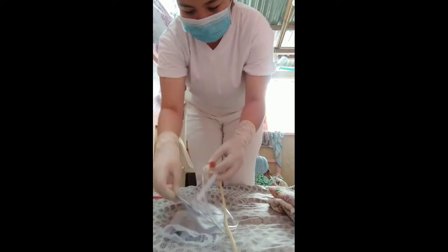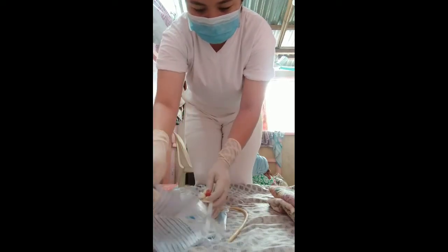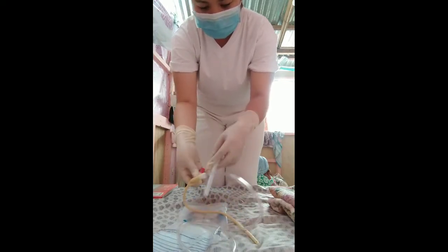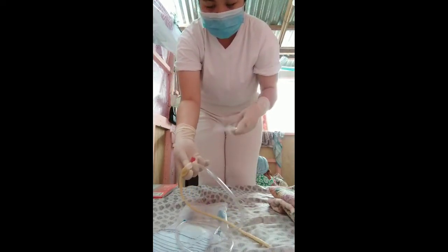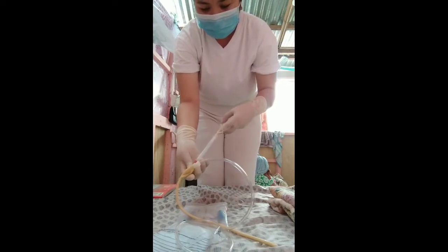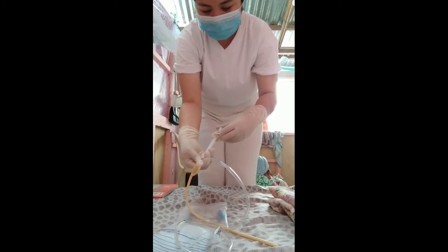So this is the catheter and the urobag. Let's assume that we insert the 10 cc of water into the port of the catheter. Okay, I insert the water.